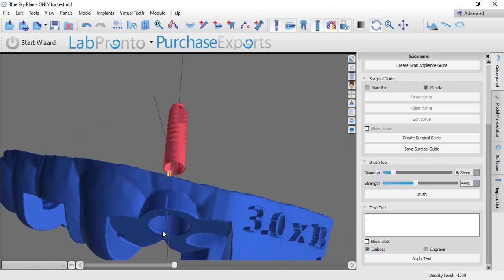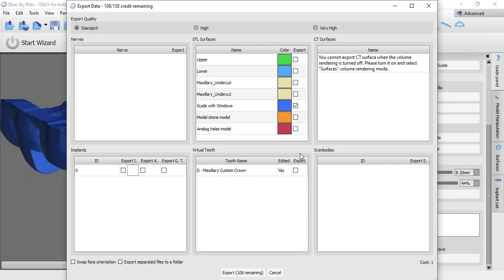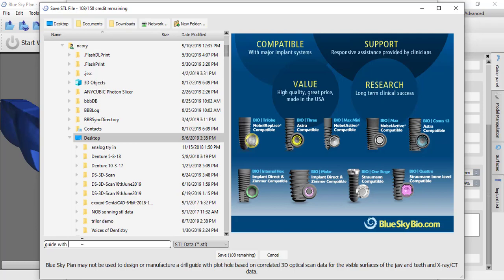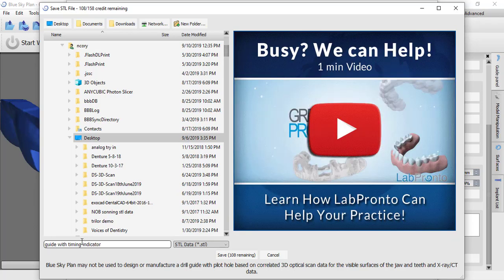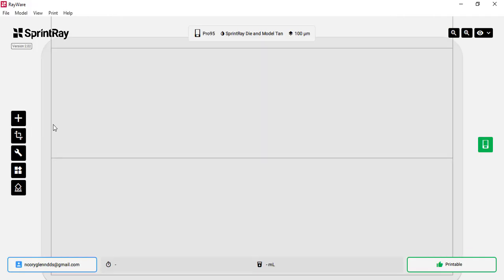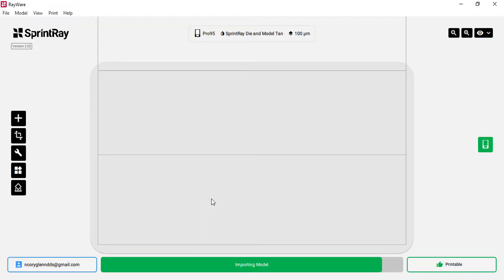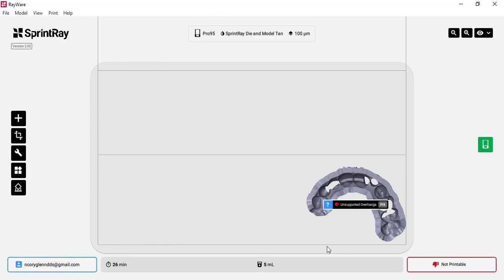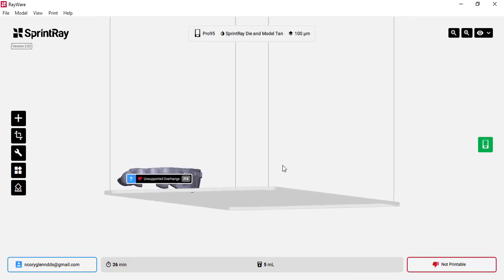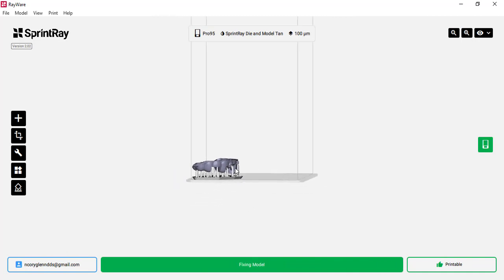I'll zoom in and really scrutinize this — going straight through there, it looks perfectly lined up. This is going to be our surgical guide that we print. I'll bring that model into my SprintRay Pro software off the desktop — this is 'guide with timing indicator.' We just need to support it where we can and print it.